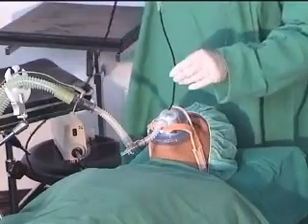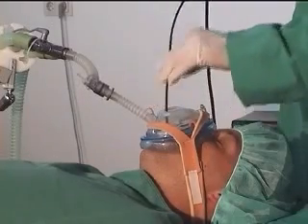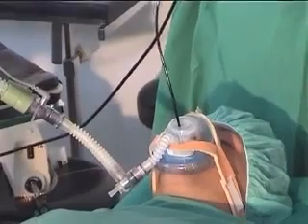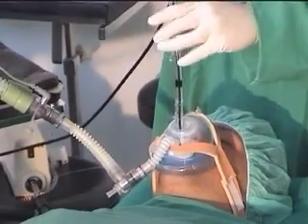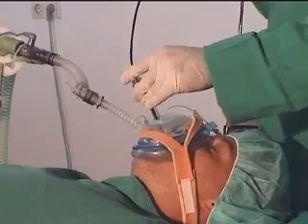Guide the flexible fiber bronchoscope through the hole of the membrane and through the vocal cords into the trachea. The endotracheal tube can then be pushed along the fiber bronchoscope through the same hole until it is in place.